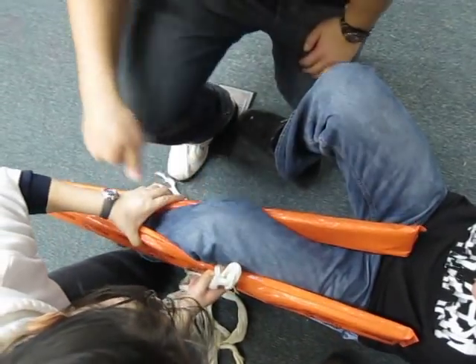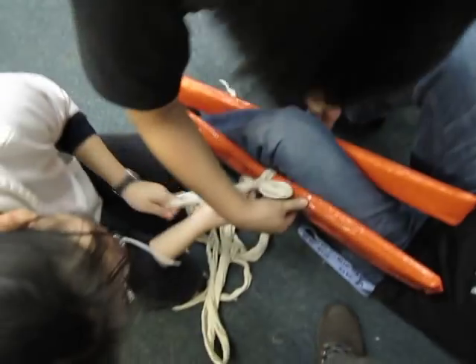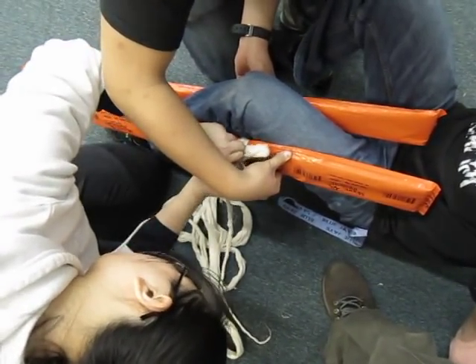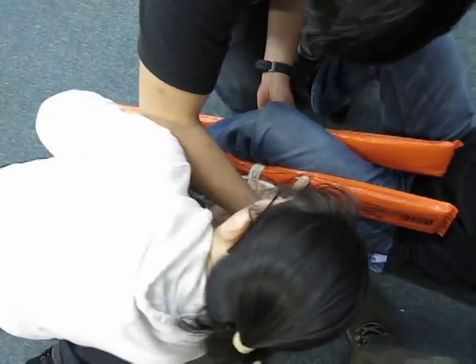It goes down a little. Ideally, it wouldn't go down. Hold it — can you hold it again? So if you find that it goes down and you're not happy with it, you can always undo. And then try to tie it even tighter.